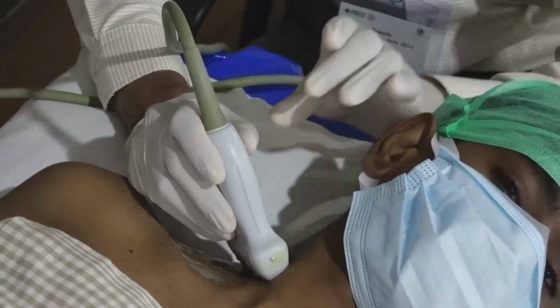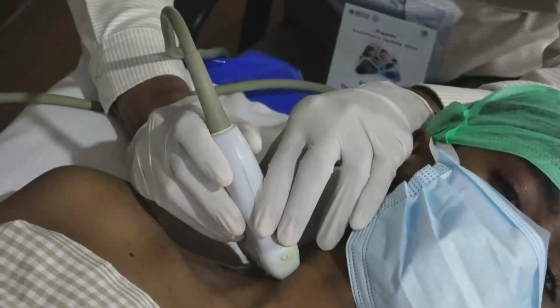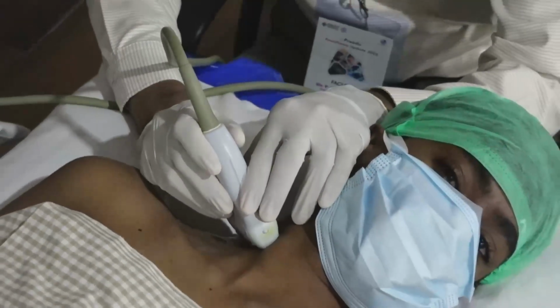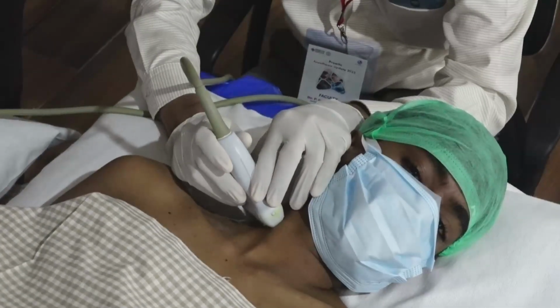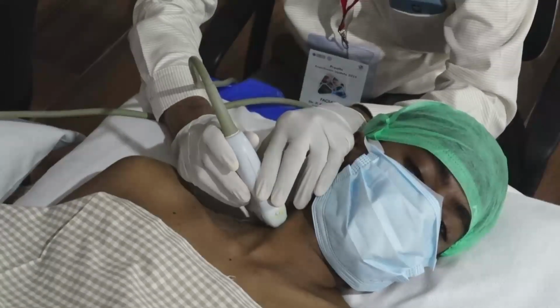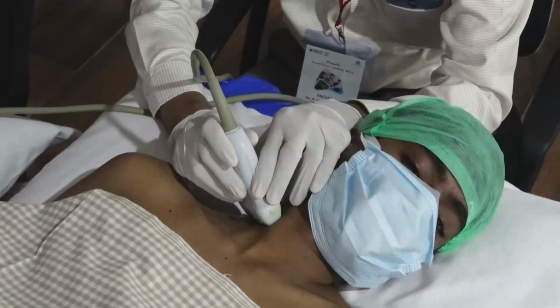Now I will move the probe cranially, and here we look for the other transverse process components. The anterior component is either prominent or bigger; the majority of the time it is prominent. Now we can see one component coming out and going inside.